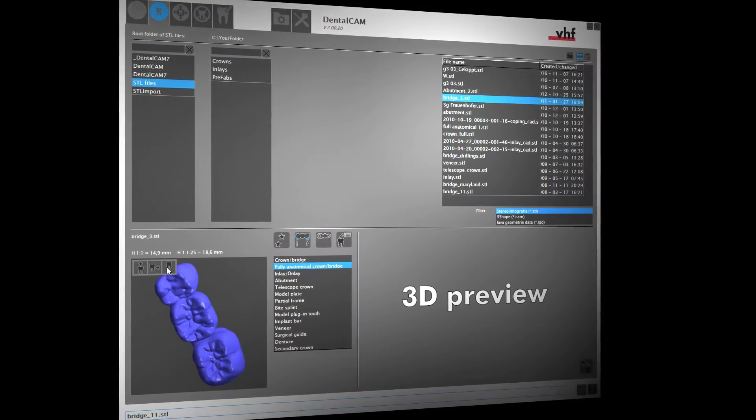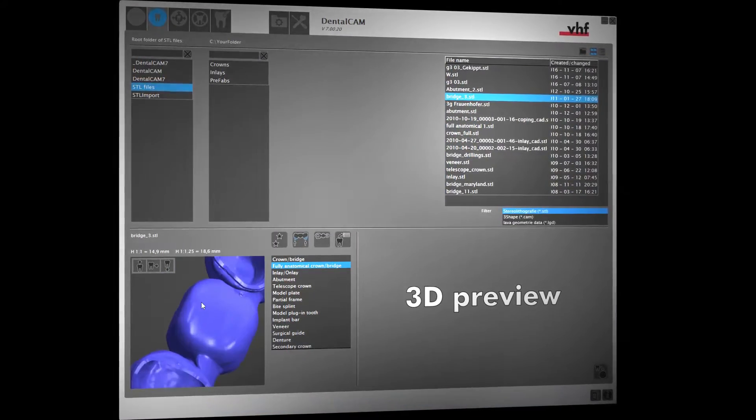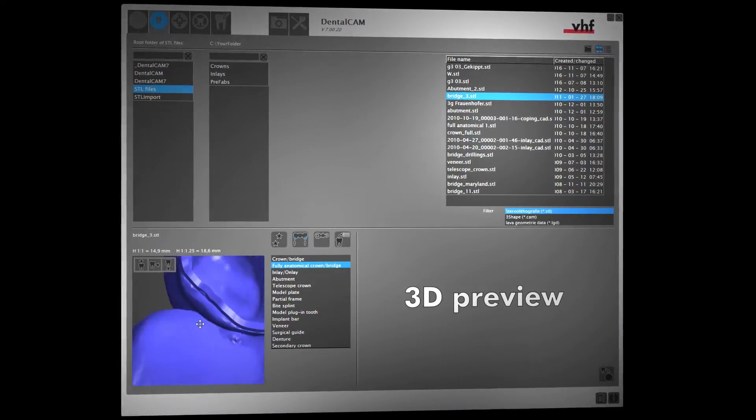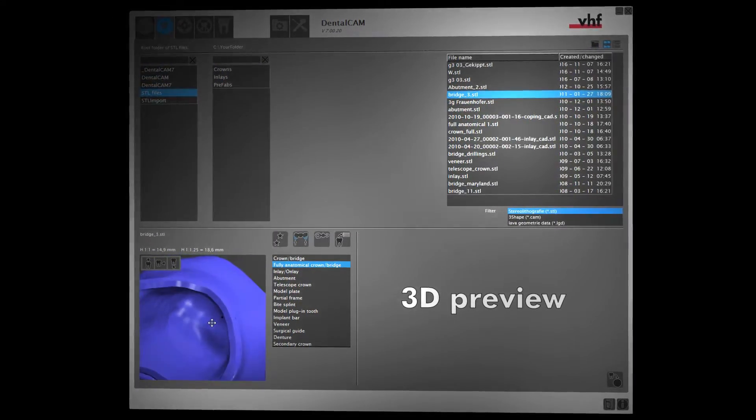We've now even made a 3D preview available directly after you select an object in the import view.